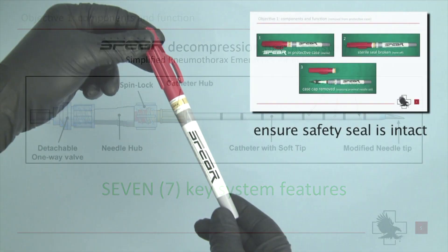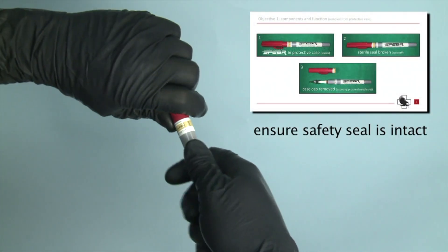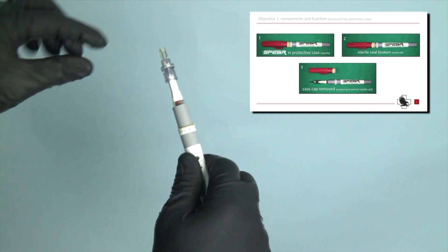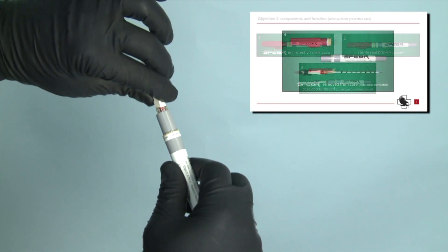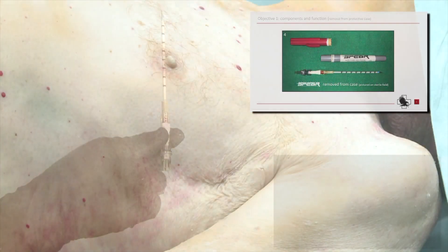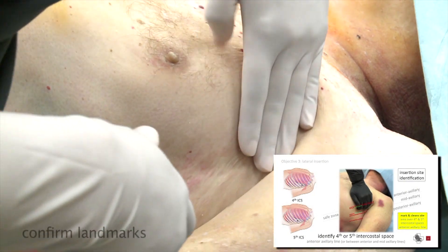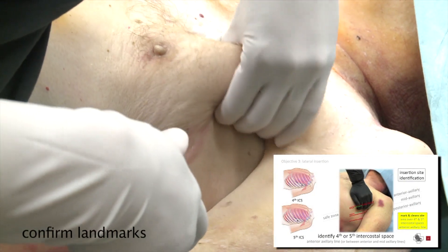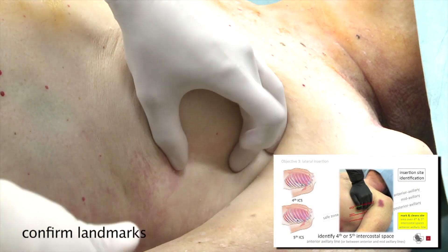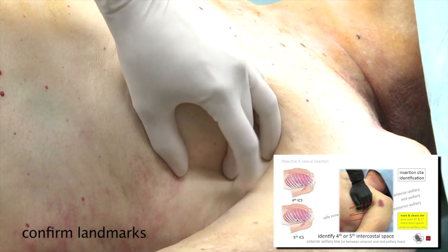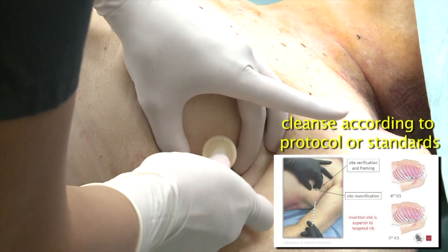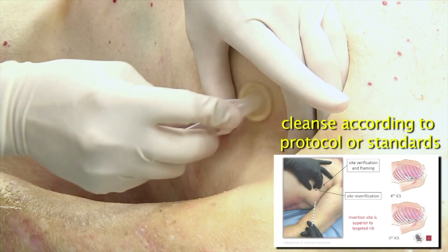Grasp case and ensure safety seal. Twist off cap and remove SPEAR. Confirm landmarks: fourth or fifth intercostal space, anterior axillary line. Cleanse according to protocol or standards.